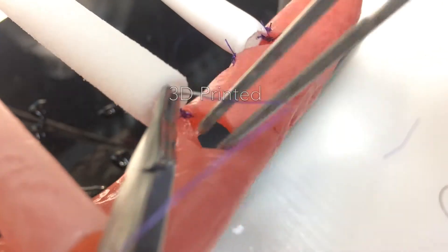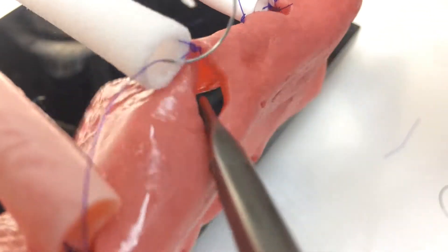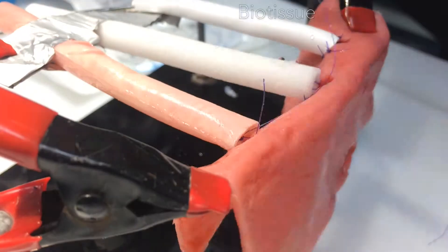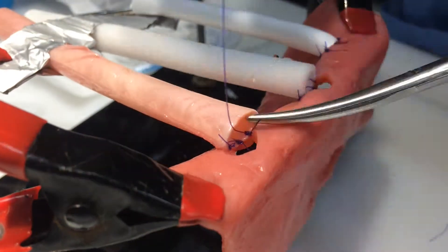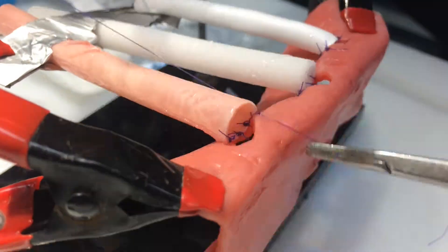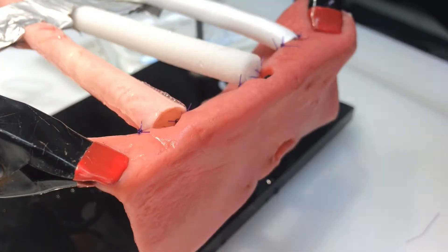Again, in the 3D printed material, it's almost impossible to pass the needle through adequately. Here with the biotissue material, this is what you want — a tissue that forms towards your anastomosis and is really easy to suture on, but also easily damaged.